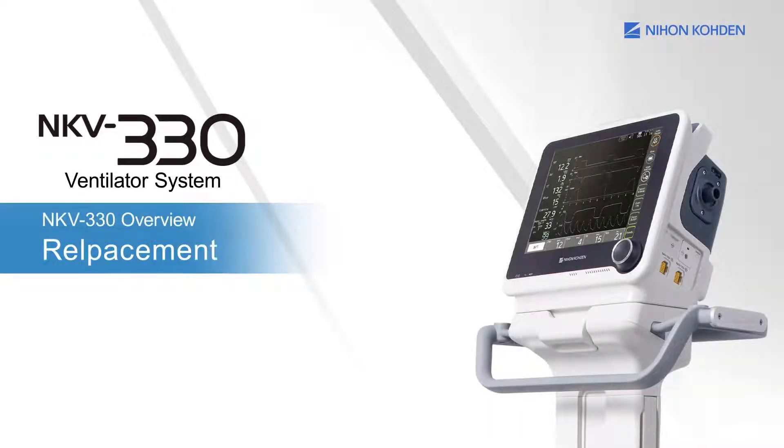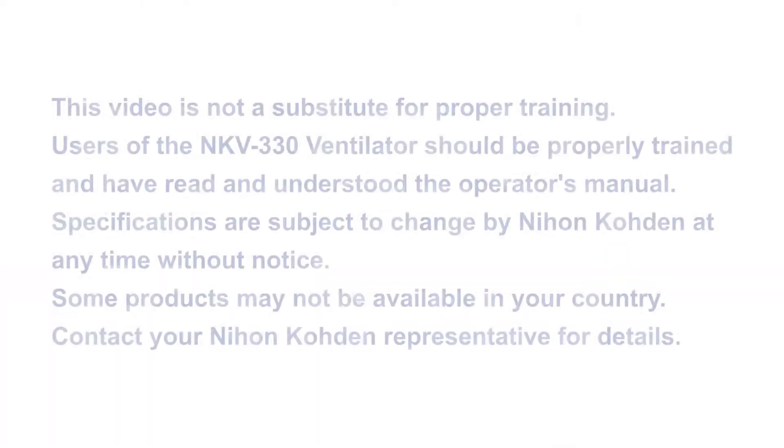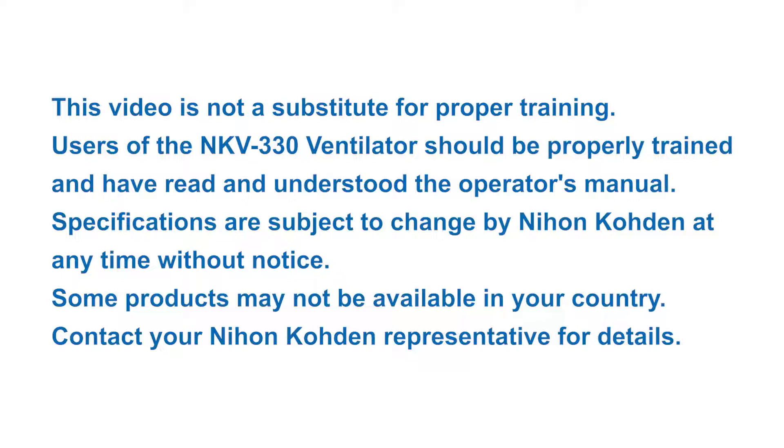This chapter explains how to replace the air intake dust filter and the fan filter. This video is not a substitute for proper training. Users of the NKV-330 ventilator should be properly trained and have read and understood the operator's manual.